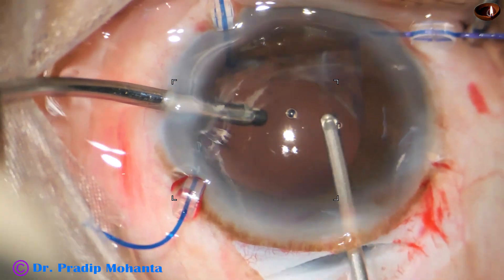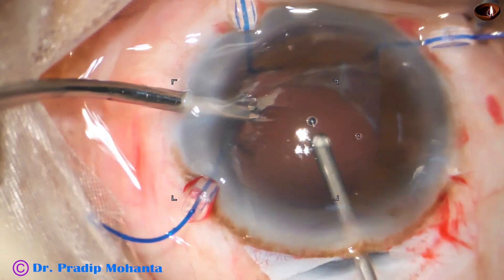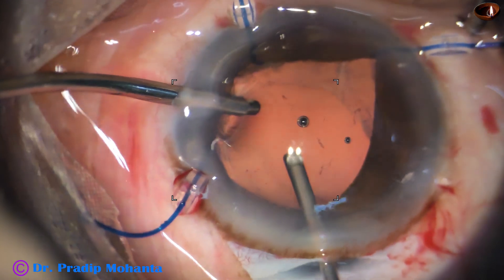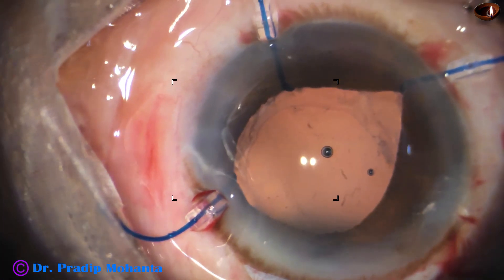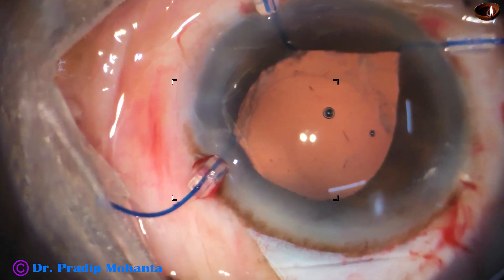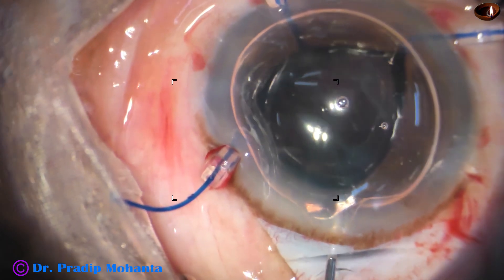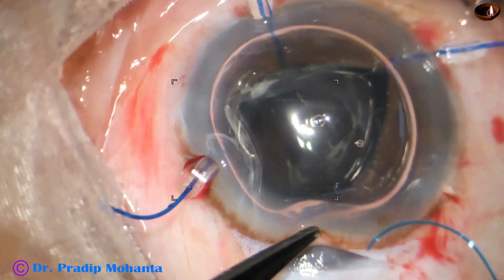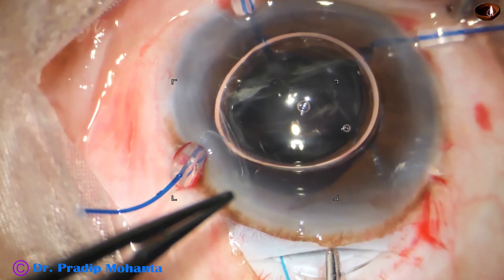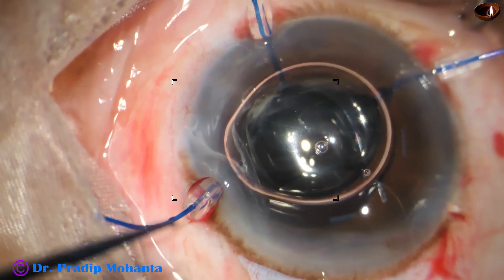Once this is done, the pupil becomes round and we can place the intraocular lens. I usually use an air bubble to form the anterior chamber and then inject the intraocular lens, because if we use visco at this time, a lot of it will go into the vitreous cavity and removal will be difficult — we would have to use the vitrectomy cutter for a long time. With air, it is possible to place the intraocular lens over the iris, and now I place the intraocular lens over the iris.